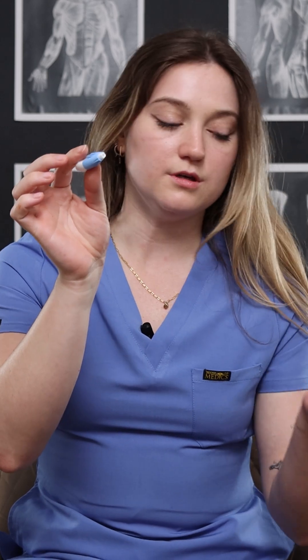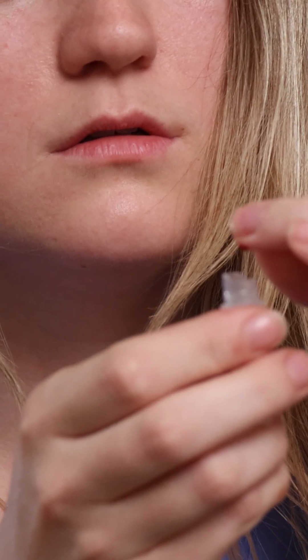I like to use my ring finger with this needle. What you do is you just press firmly — there we go — to get a little bit of blood, and you just squeeze. We've successfully got my blood sample.